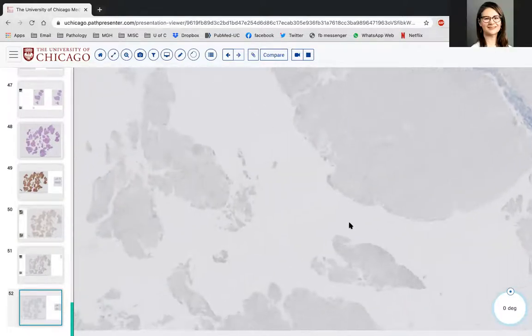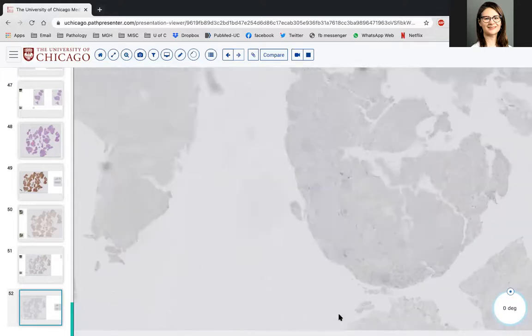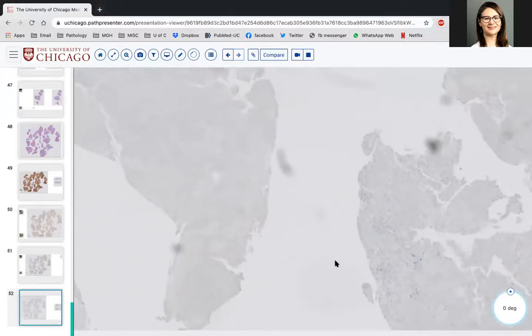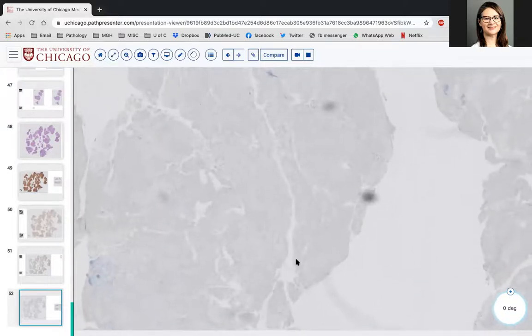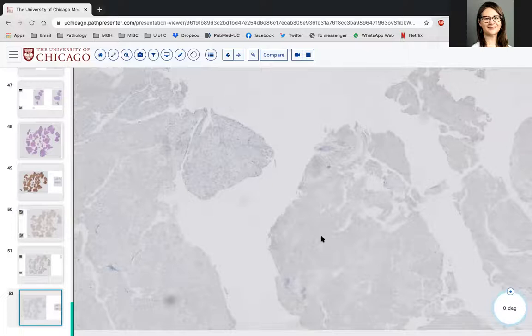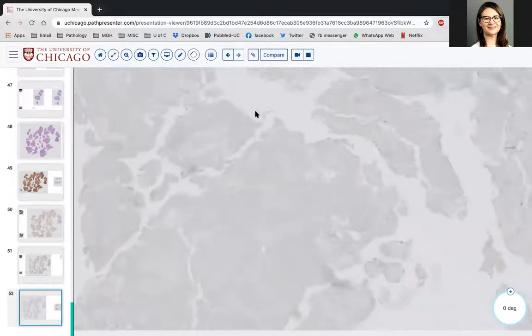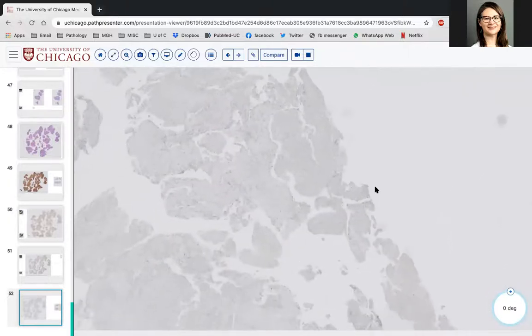And in this case, when you have a cellular schwannoma, always remember that your overlap could be with a myoepithelial tumor of parotid gland. And in this case, the absence of any clear keratin or EMA would essentially exclude a myoepithelial neoplasm.